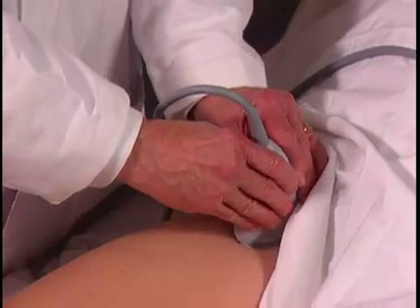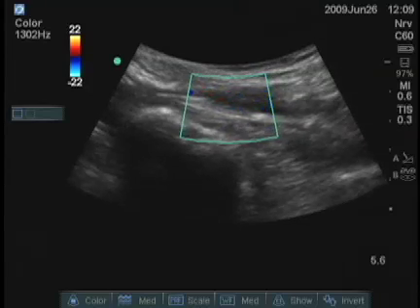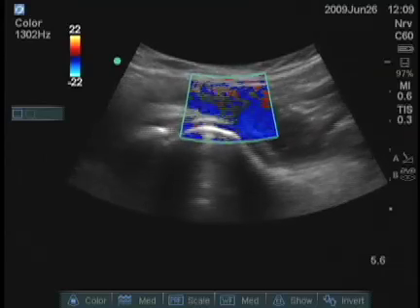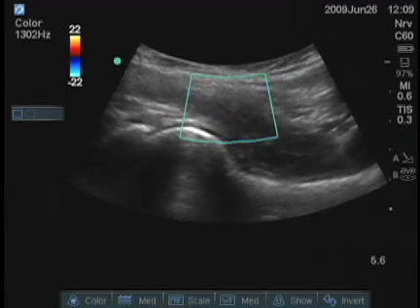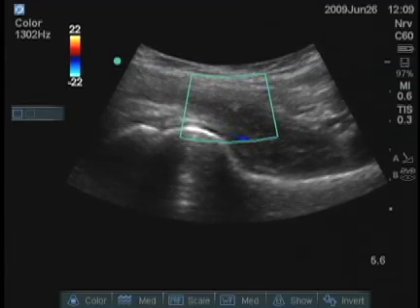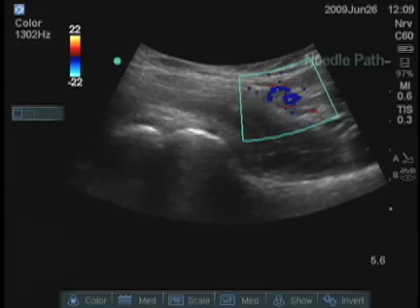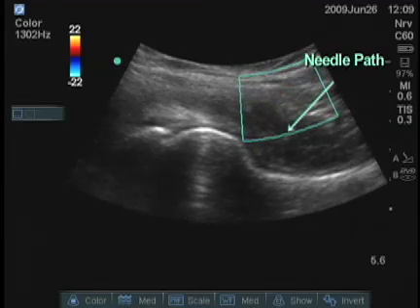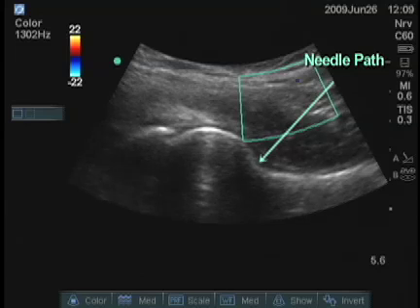When I turn back longitudinally, I see that those vessels are medial to where I was looking before, and now that area I've examined does not have blood vessels. Sometimes it's a good idea to look in this area, because that's the direction the needle is going to be coming, to make sure there are no branches of the femoral artery or vein going in that direction.